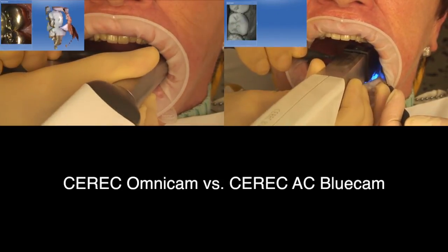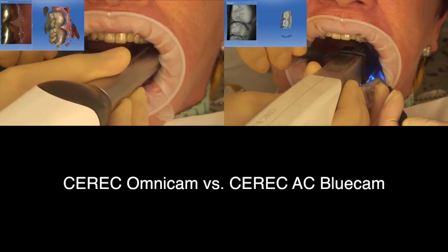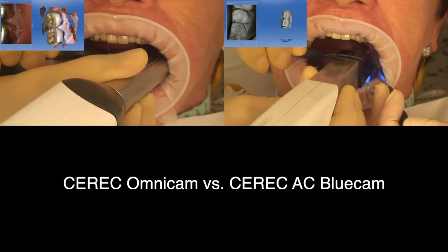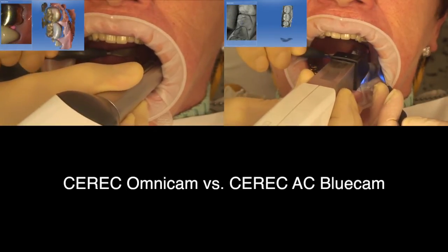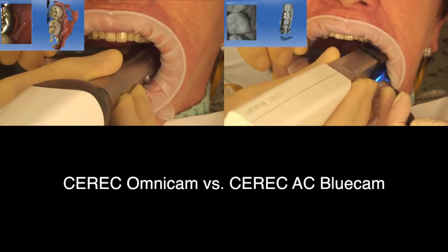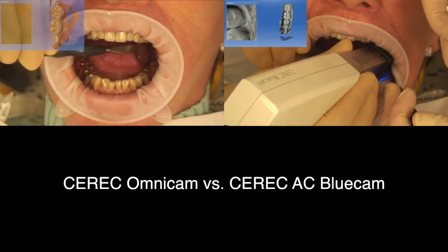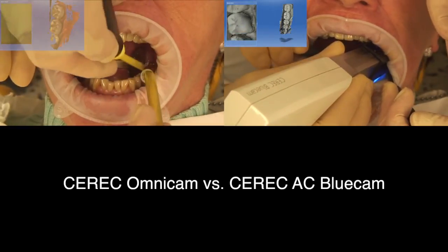So we switch to the setup phase, and first we register the situation with the Omnicam and then with the CEREC Bluecam. On the left side we can see the Omnicam image set up with the Bluecam, and on the right, parallel to that, we can see the Bluecam image. The Omnicam doesn't need to be powdered like the Bluecam.